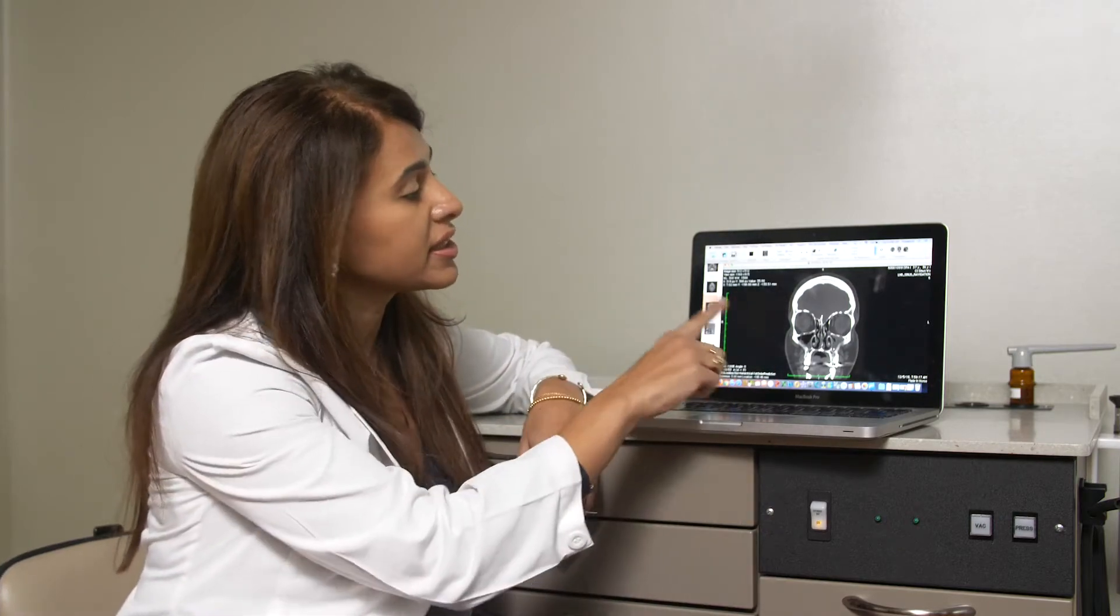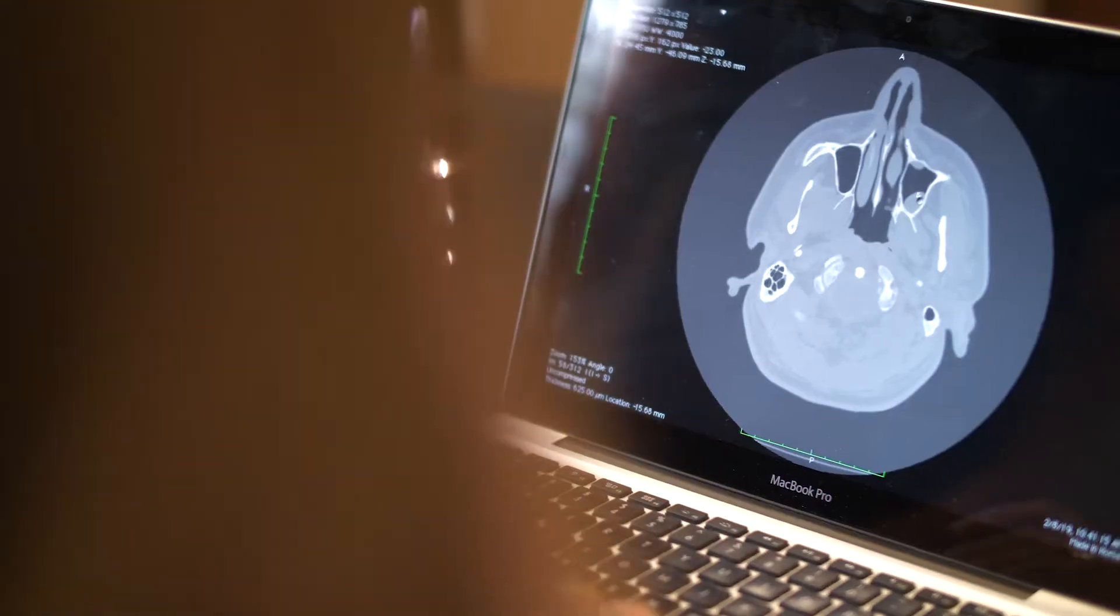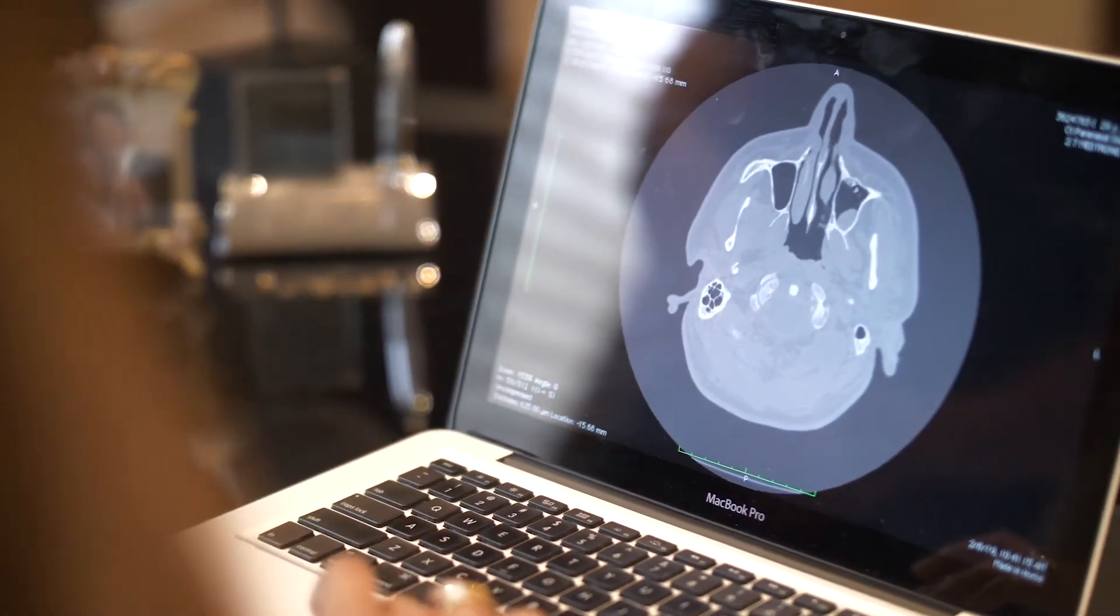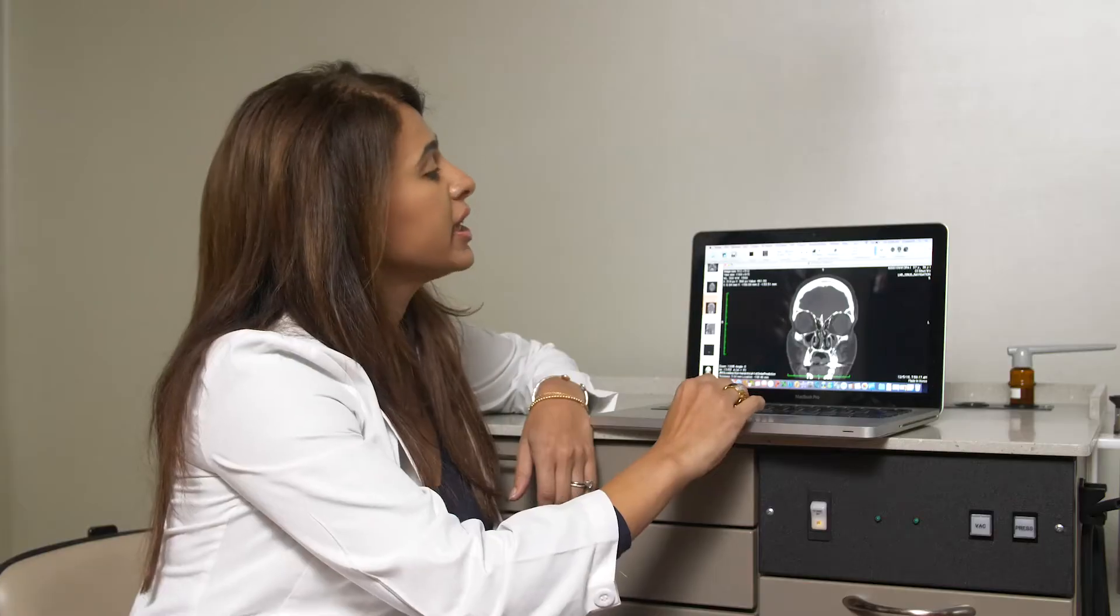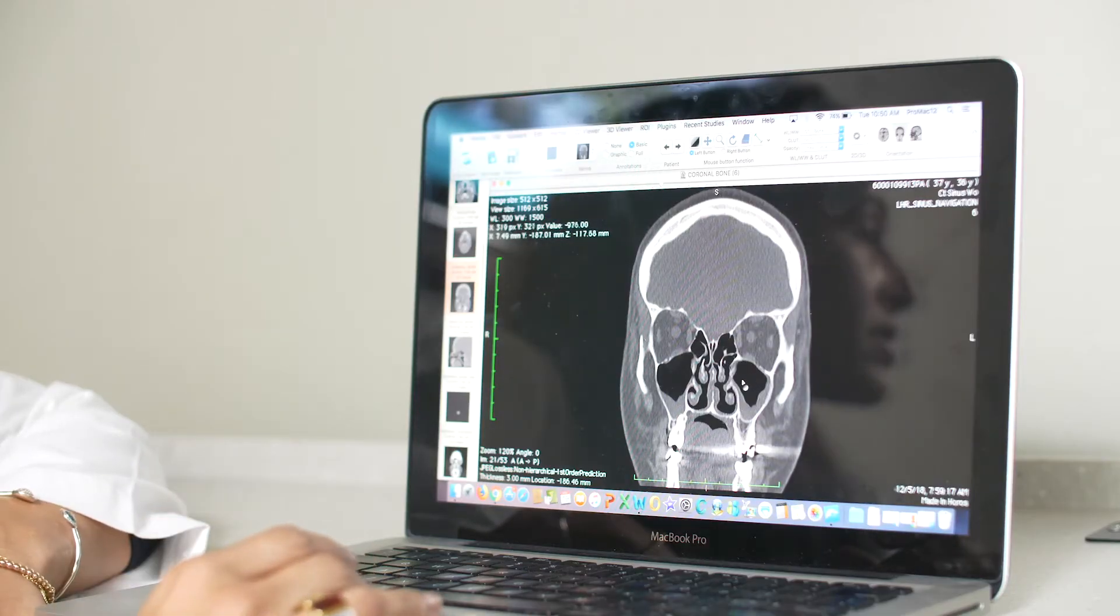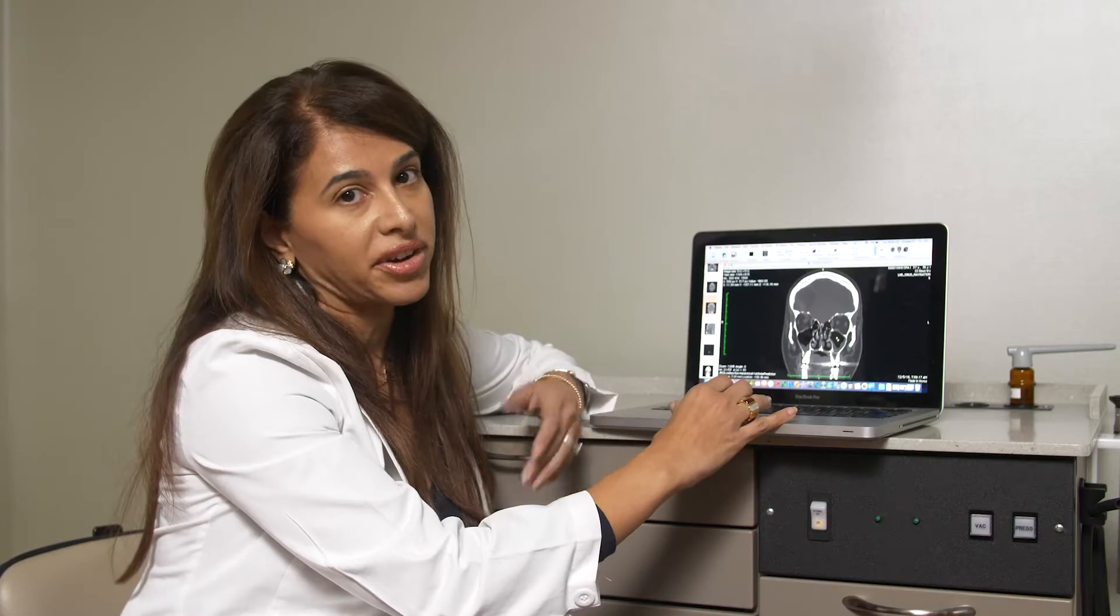Front to back looks like your face. So it's the one that's going to be the easiest for us to go over. The pictures are taken as cross-sectional images, so slices from the tip of your nose to the back of your head. And when you're looking at a CAT scan, all you really need to know is that the bone is white, air is black, and everything else is gray.